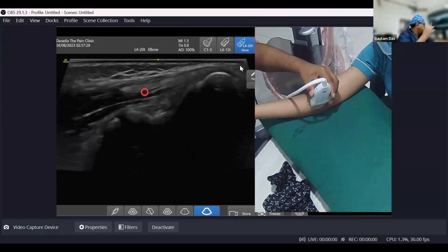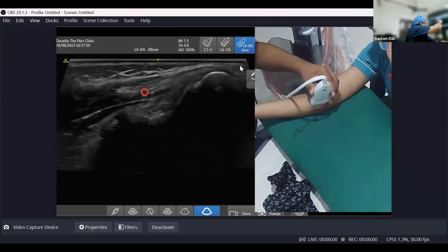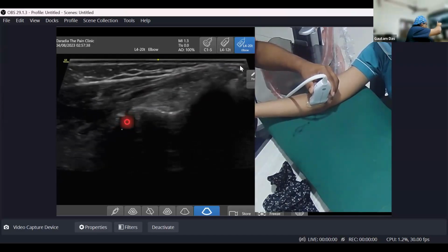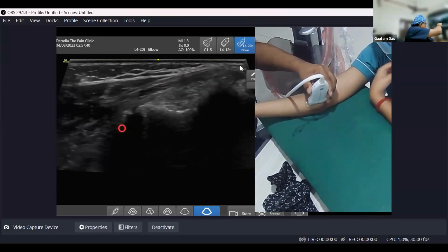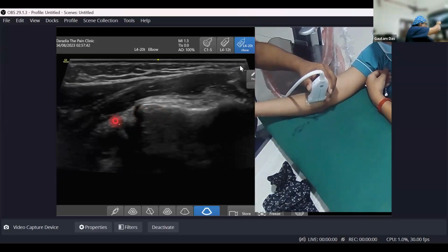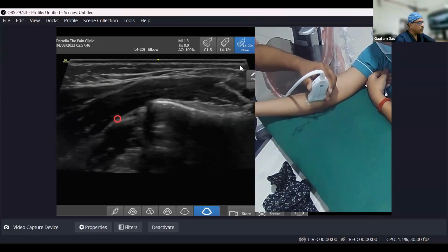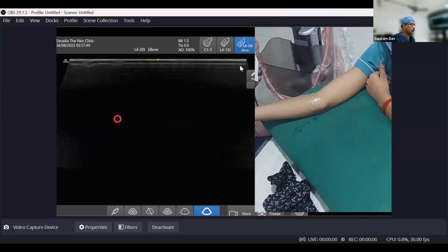So what is this? This is your medial epicondyle. This has a very big slope. And what is this? This is your sublime tubercle. If I'm holding it like this, sublime tubercle. Anteriorly, the same tubercle is known as the coronoid. But here, oh, anteriorly, I have forgotten, sorry.